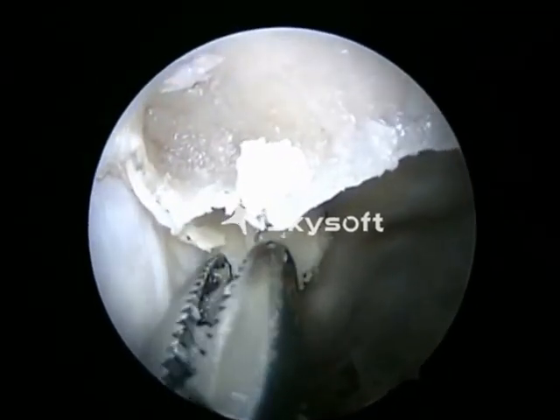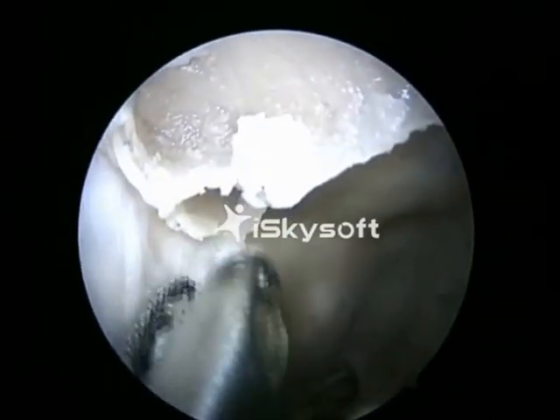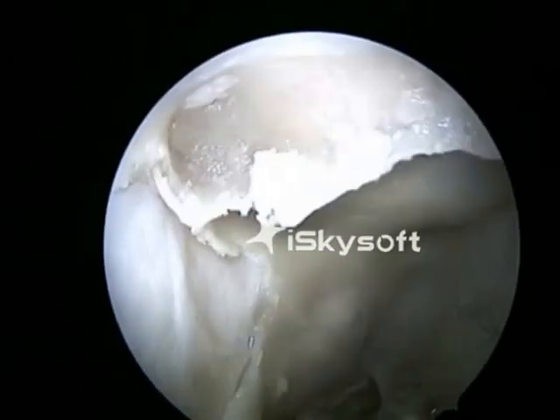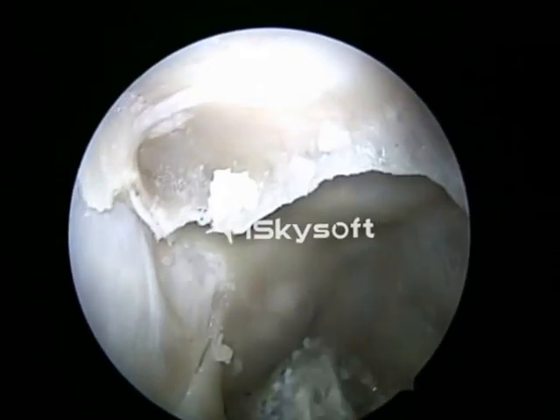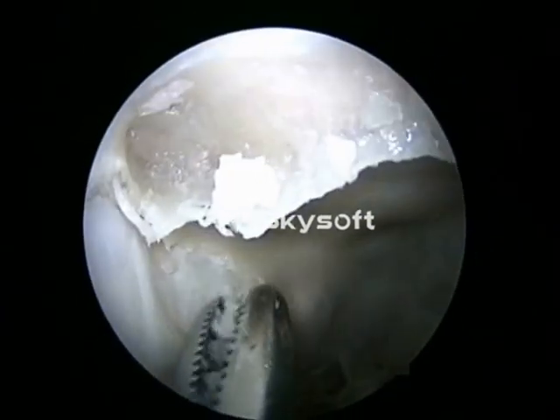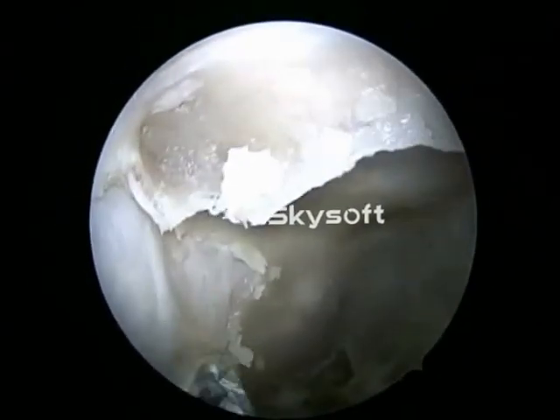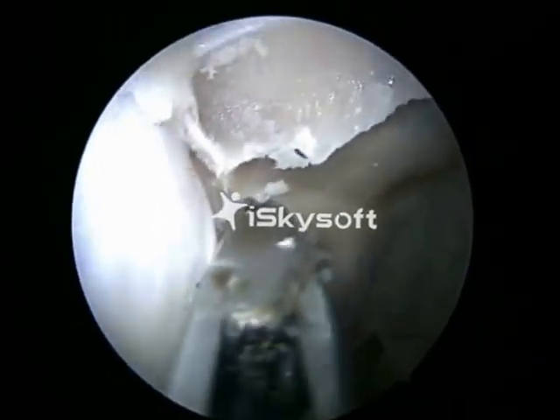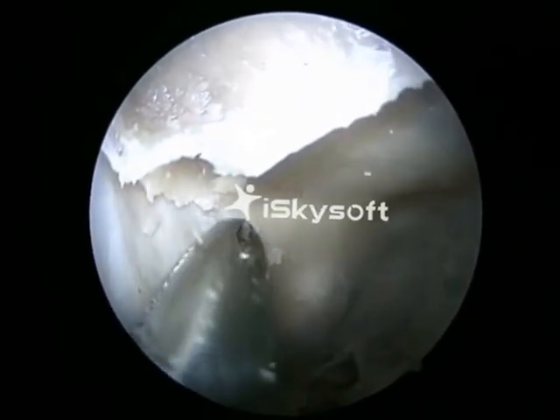We are now removing the bone of the optic canal. In a live situation, it's better to use a diamond drill, make the bone eggshell thin, and then remove the eggshell bone with a Freer's elevator.